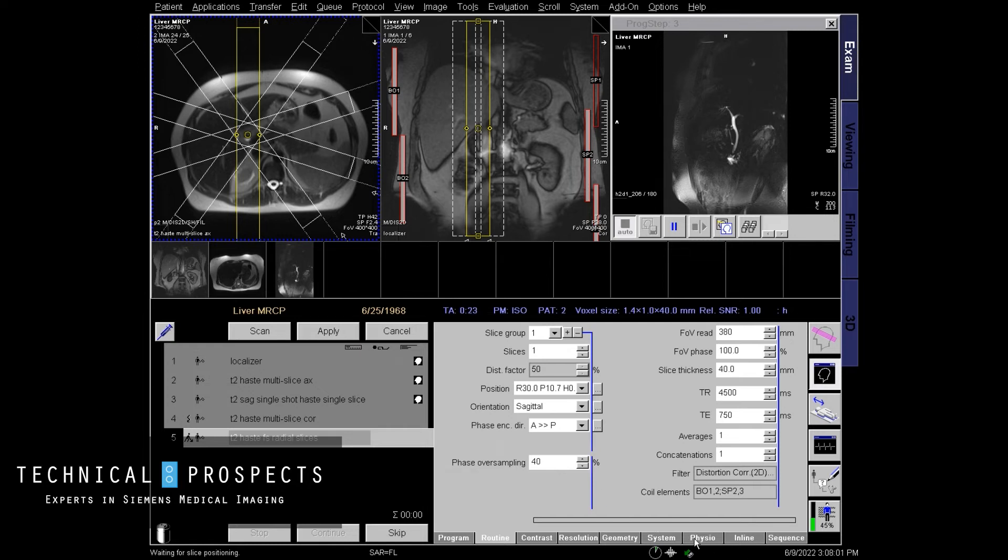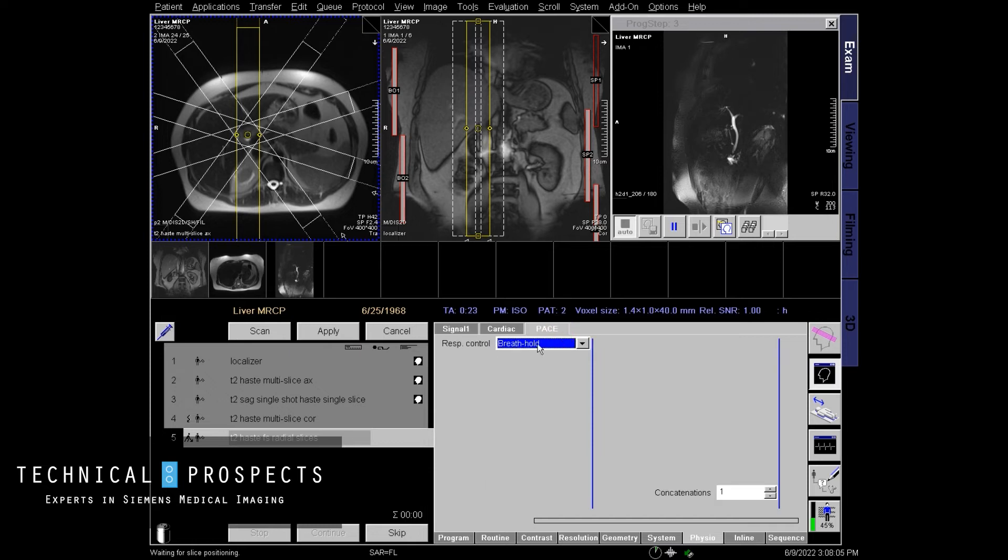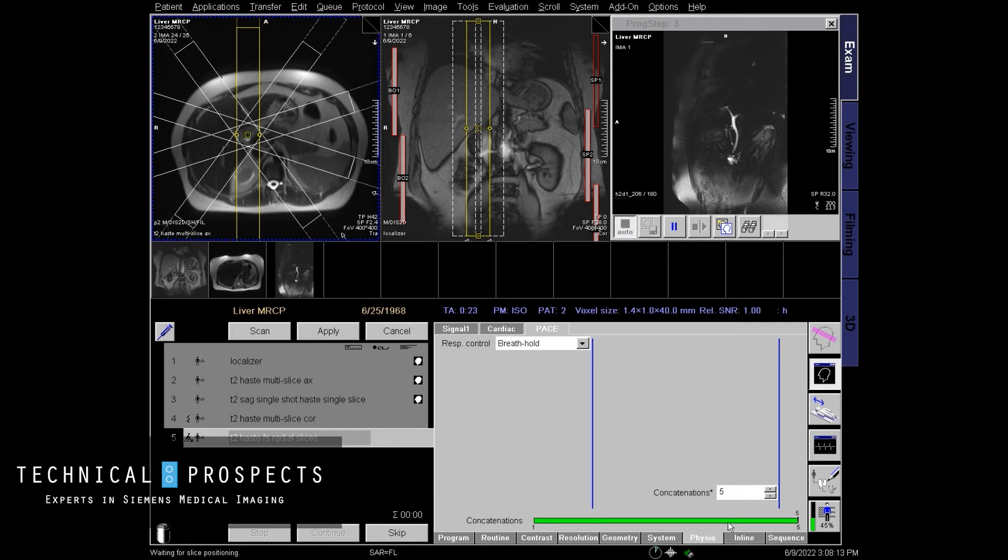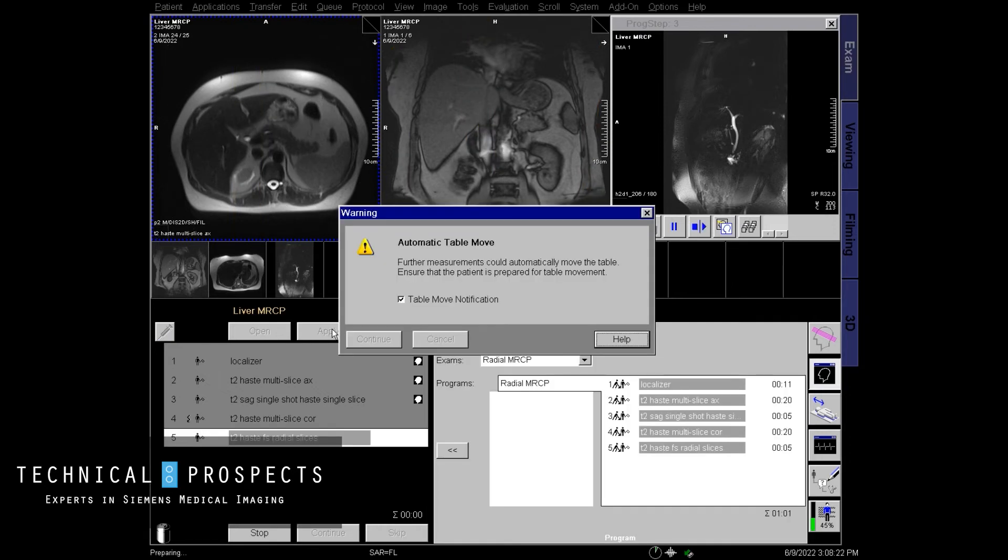One last thing you want to do is go to your physio tab, your pace tab. You want to make sure breath hold is turned on and however many slices you selected, that is how many concatenations you want. So I chose five slices. I'm going to select five concatenations. I'm going to hit apply.